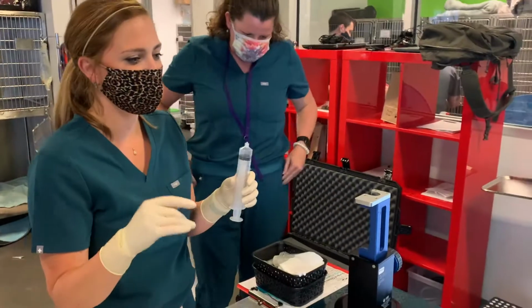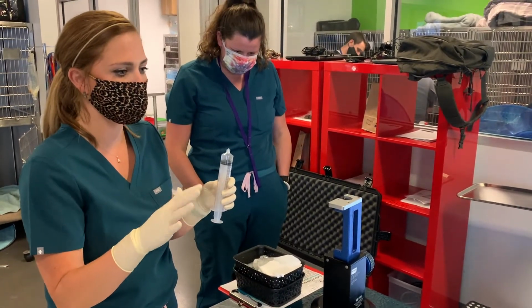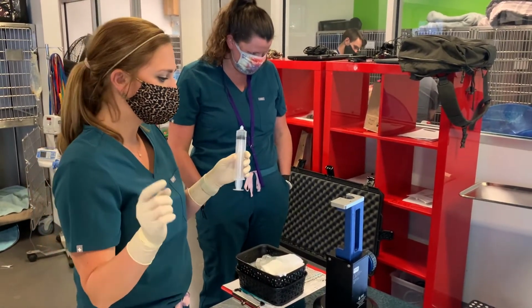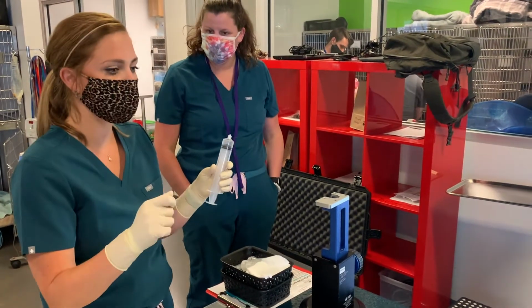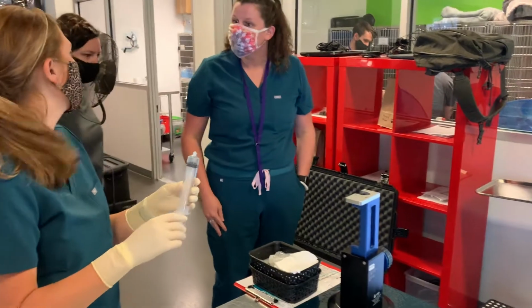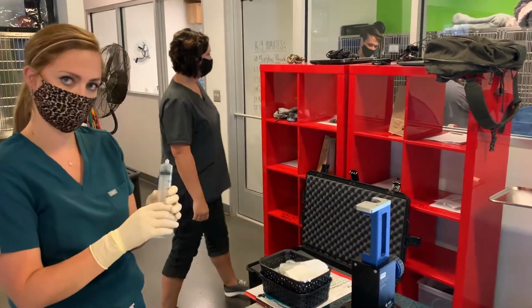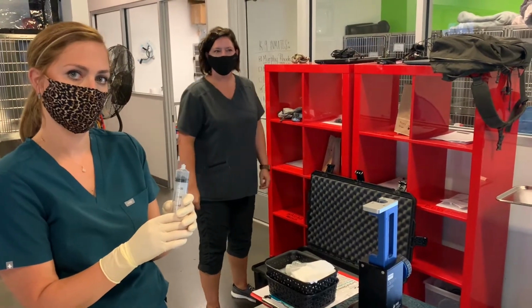It's by weight, and it all depends on how many mils of the PRP you want to get out. It's about 10%. They're going to talk in a second, but we're just going to go draw blood so we can start processing while they talk. Can I get a 20? And you wouldn't have to do 9, but 9 is going to give you about 4 hours to work with.